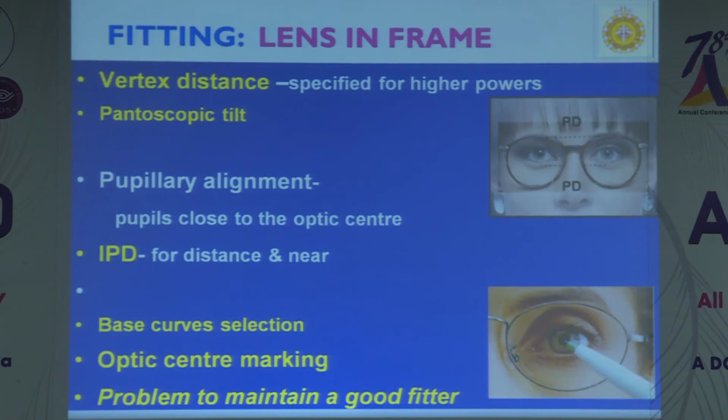And fitting of the lens is also important. I think Radhavan will highlight the problems with eye strain and all this, the problems with the fitting and everything. The software is also available. It takes all the measurements.